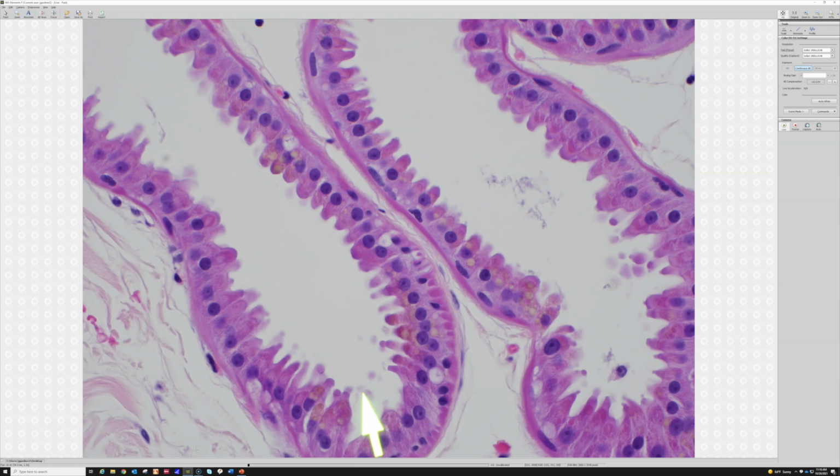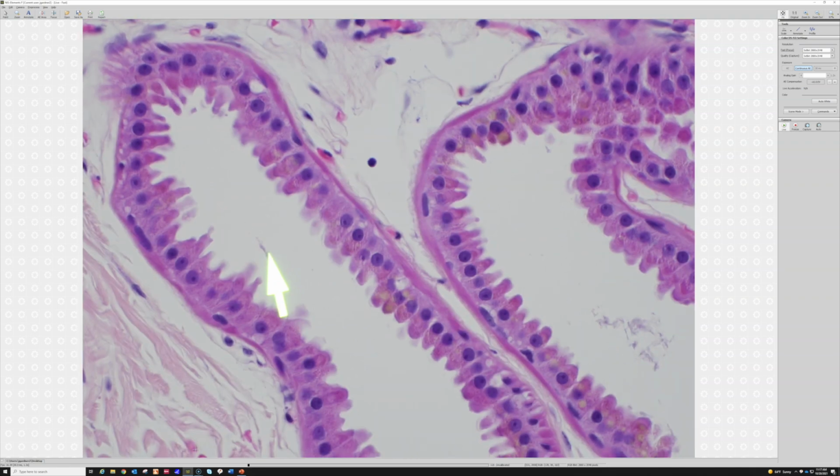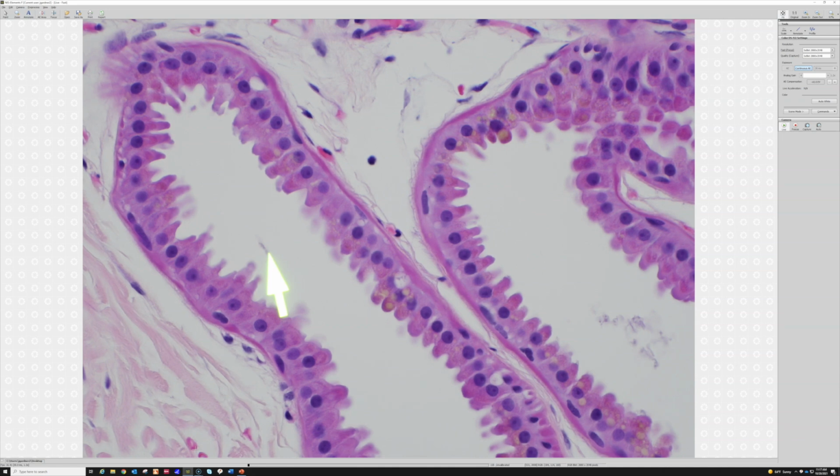But actually the secretion method here is similar to the secretion method in eccrine glands, which is merocrine, that the little vesicles of secretion come to the cell membrane and fuse with it and release their contents across the cell membrane into the luminal space, which then makes the secretion, okay? And the secretions from apocrine glands, I believe, can be acted on by bacteria on the skin surface, and that contributes to the production of body odor.